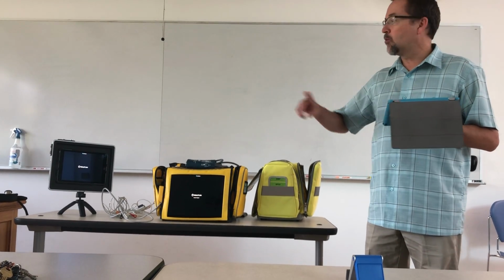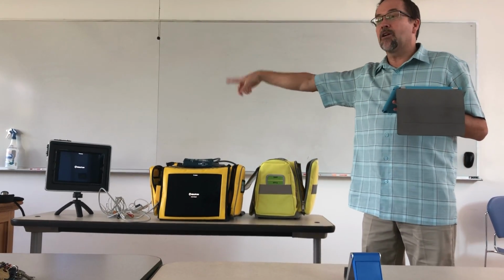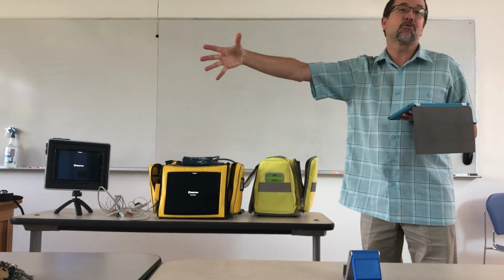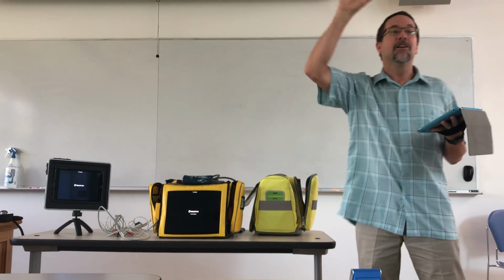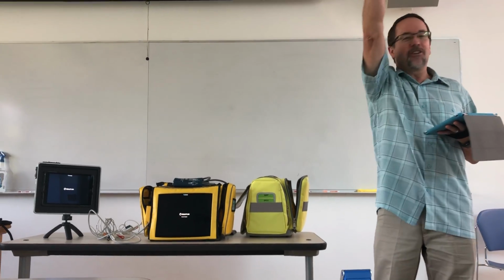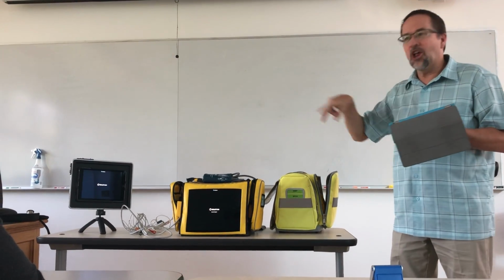And if you're not too far away with an Apple TV, you'll have to get an HDMI input into something, but if you've got an Apple TV hooked up and you're not running the scenario far from the room, you can have it live streaming the video with the vital signs and parameters to students that aren't in the same room as the scenario. So they could be, in our new classroom design, we've got scenarios that are adjacent to our classroom, and that was intentional because I can have 3 students in a scenario room running the call while everybody else is sitting out there watching it on the big screen and critiquing it, doing the voting, all that stuff without trying to cram everybody into the space where we're doing the scenario. So yeah, there's lots of options either at the time or as a review.